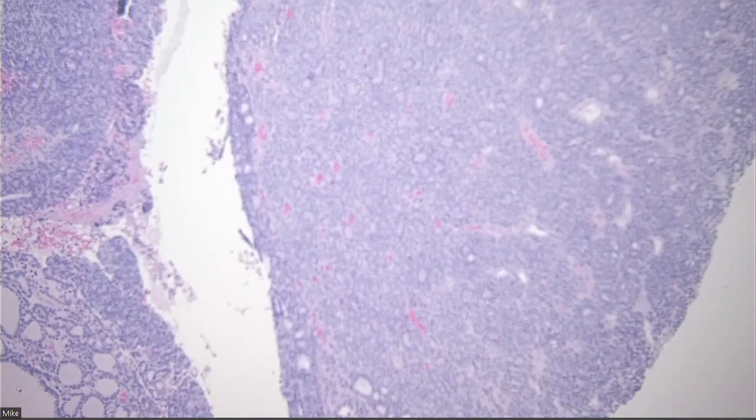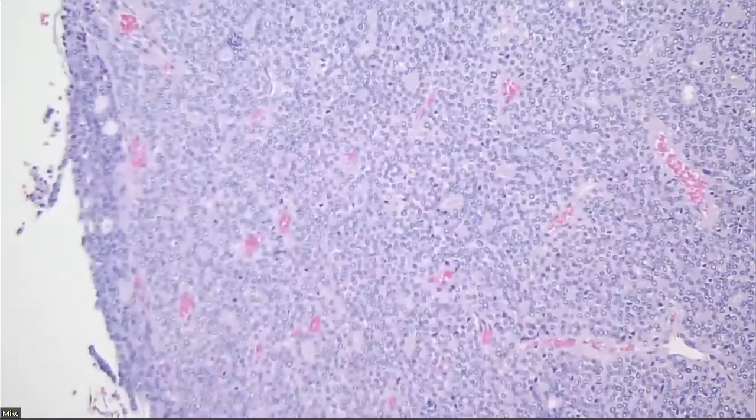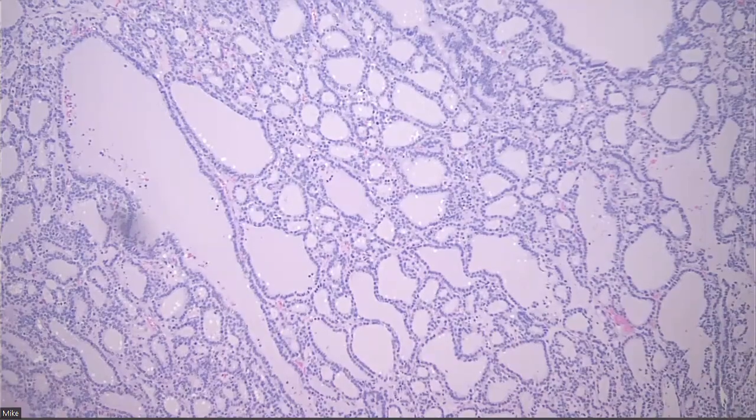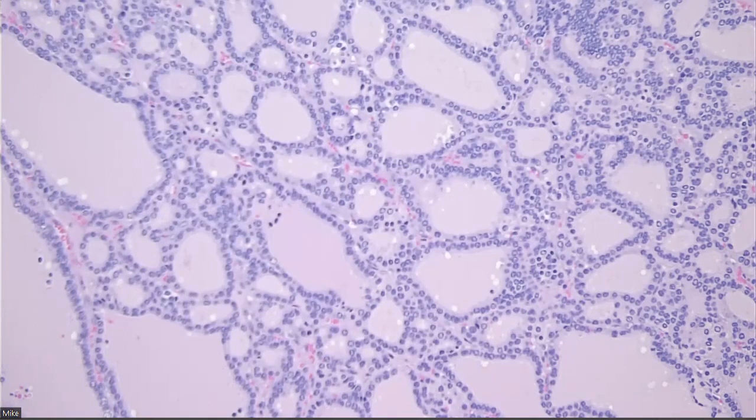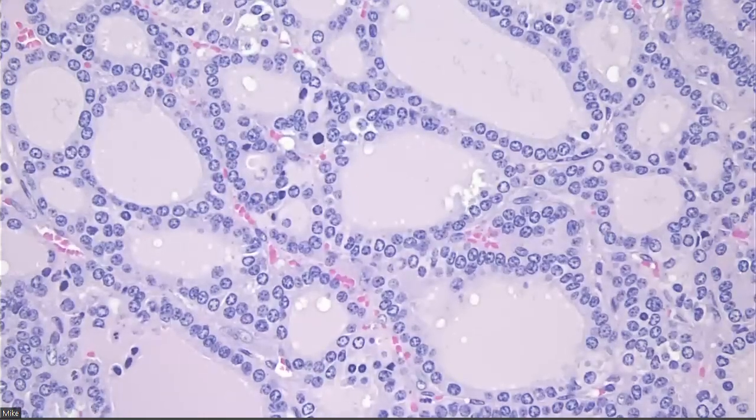But you can have high-grade cancer that doesn't have solid growth, but that has a ton of mitoses and/or necrosis. Even in this follicular area, even in the non-solid area, you can start to see mitoses. There's a nice one in the center, there's another one up there. So be mindful of mitoses in invasive neoplasms because it might buy you high grade.